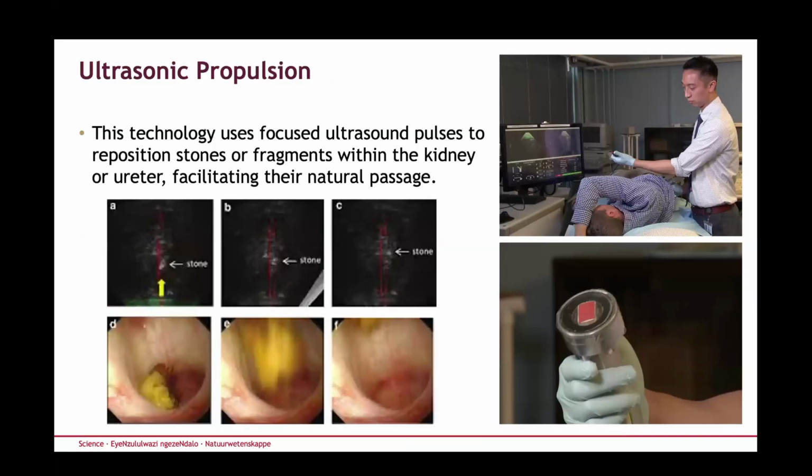And then finally, ultrasonic propulsion. This technique uses focused ultrasound pulses to reposition stones or fragments within the kidney or ureter, facilitating natural passage.